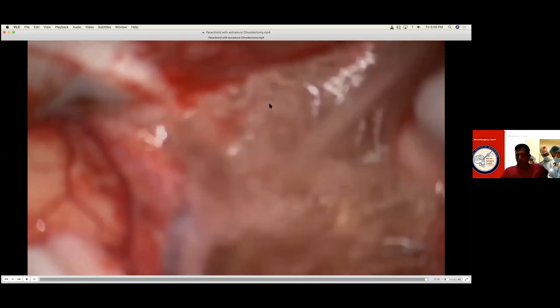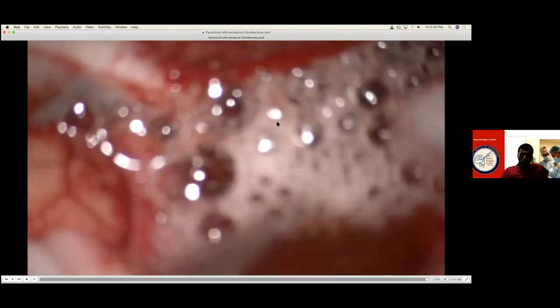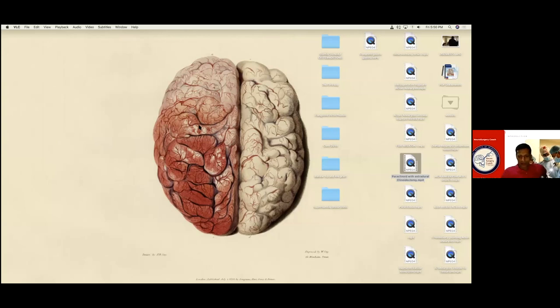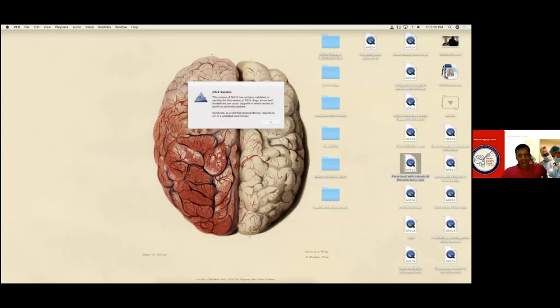That is your carotid. So you saw the complete clipping and drilling of the clinoid. Any other questions or anything else? Comments? Any questions?